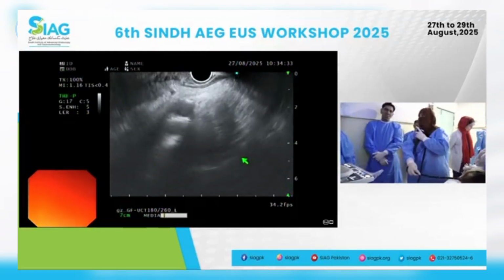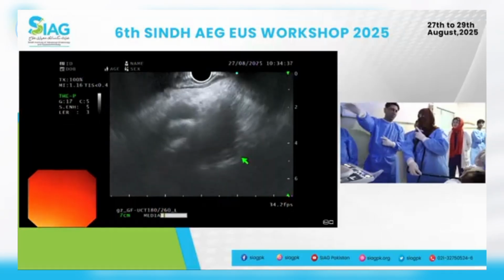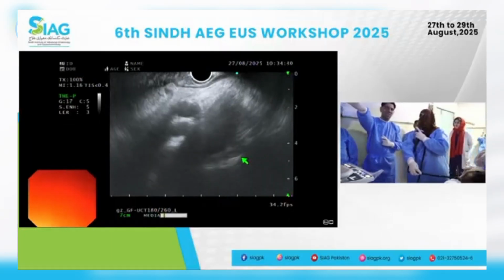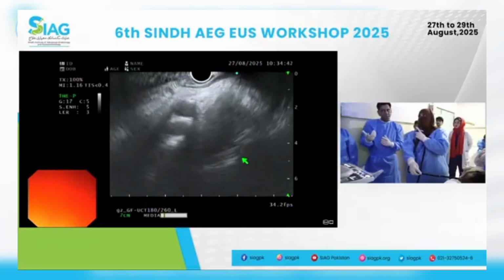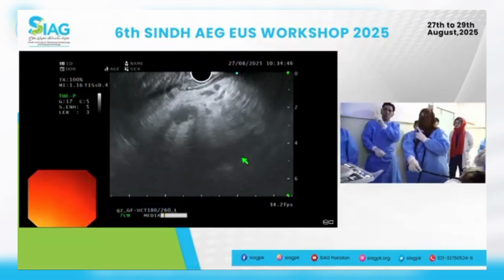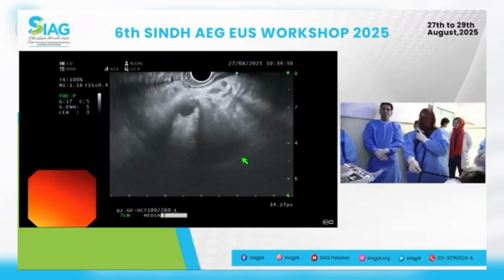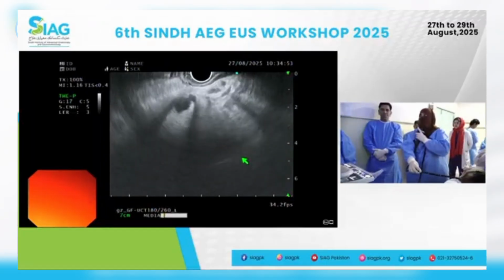One more thing you can do at this stage, remember our question that's being asked is about the mediastinal nodes. Are there any further lymph nodes around the celiac, any periceliac nodes? Okay, exactly, then there is nothing out there, nothing jumping out. There are some small ones but I don't know, the tiny ones, are they related or not? Okay, so just advance the scope.